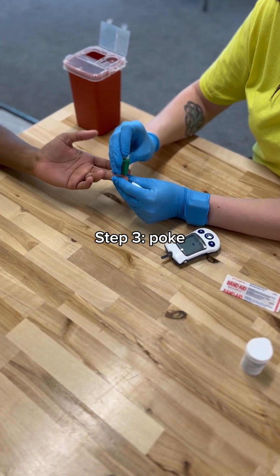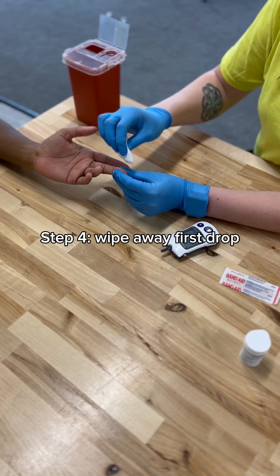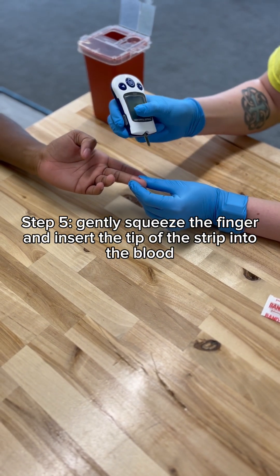And then we're going to poke. One, two, three — big poke. We are going to wipe away the first drop, and then we're going to squeeze a little bit, and then put the tip of the strip in the blood.